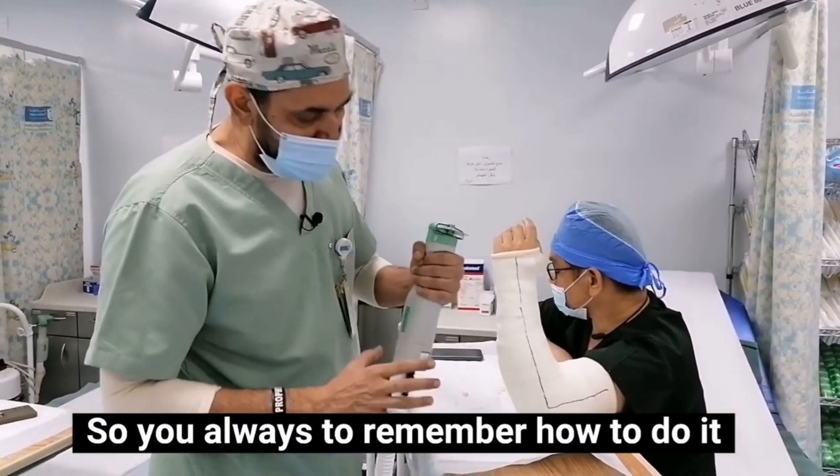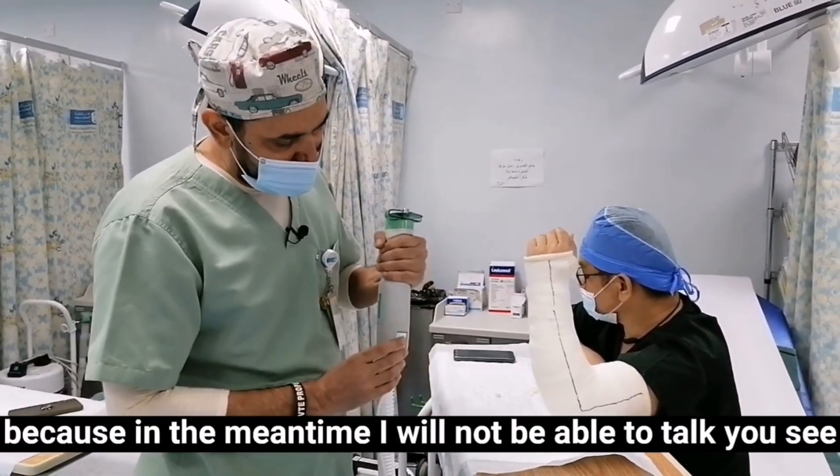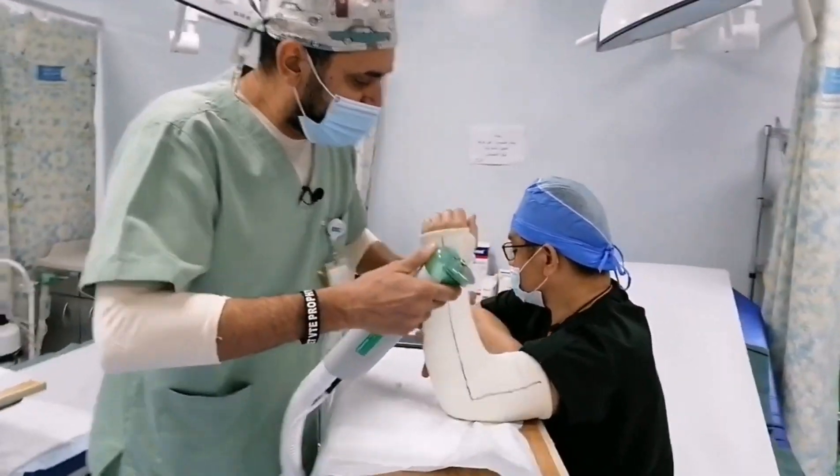Now I will start the procedure, because in the meantime I will not be able to talk.